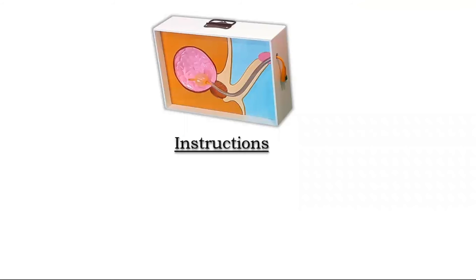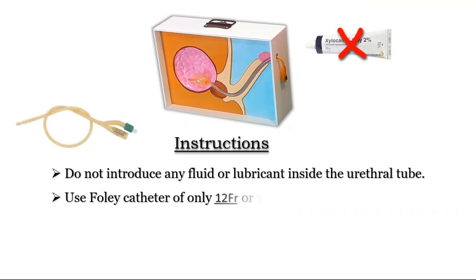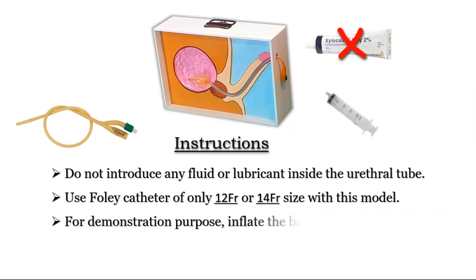Here are some basic instructions for users of this model. The urethra is made up of a transparent tube which allows smooth passage of the Foley catheter in dry state only, so please do not use any fluid or lubricant in this model. For demonstration, please use a catheter of 12 French or 14 French size only. Normally we inflate the balloon with distilled water, but for demonstration purposes please inflate it by air only.